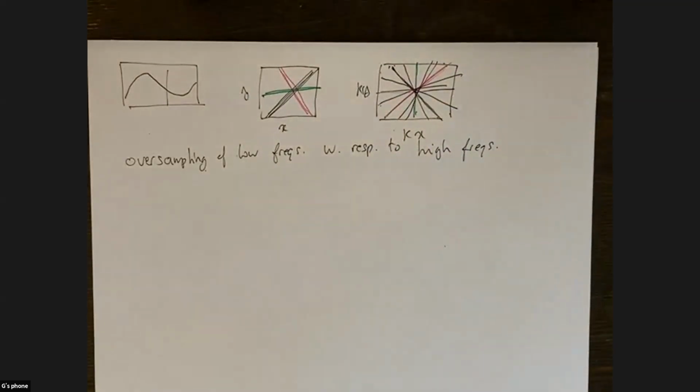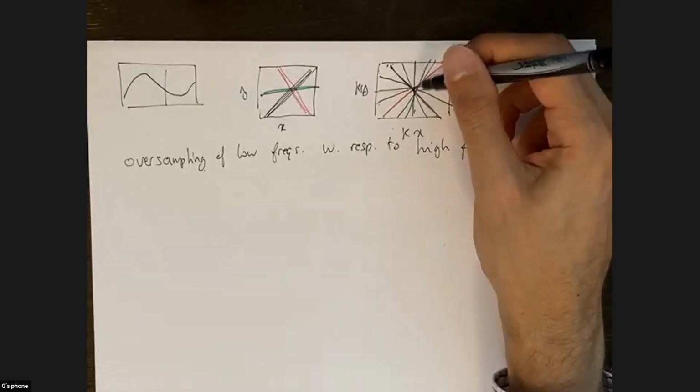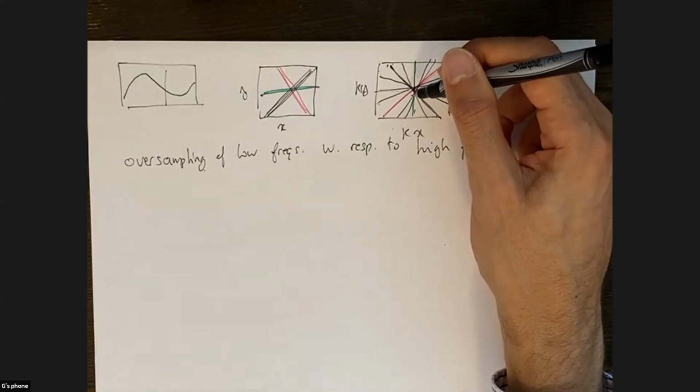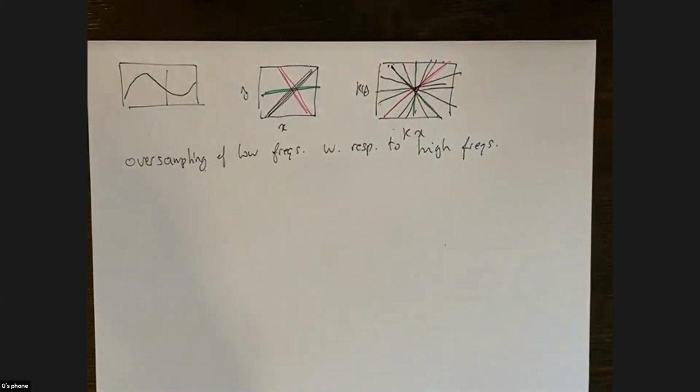That's what leads to the blur, because remember, low frequencies are the coarse details of the image, whereas the high frequencies are the sharp, fine details of the image. By doing this process of back projection, we're overemphasizing the low frequency details of the image. So the image, which was initially quite sharp, becomes blurry. The low frequencies are dominating the content of the reconstructed image as opposed to high frequencies.